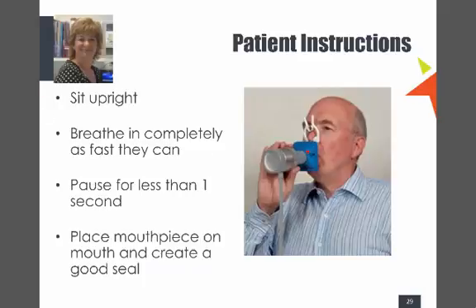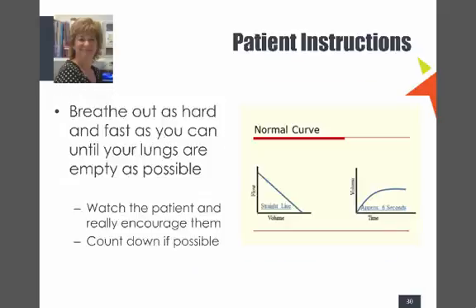The thing that is really vital is the filters. Don't use those cardboard filters that have got nothing in the middle of them, or a minor membrane. Ideally, we really need a proper filter that goes down to, I think it's 0.05 particles, especially in winter. You don't want to be spreading viruses through a spirometer. So again, I'm not going to tell you what to put into your spirometer. They're all different, and you need to go through the instructions of how to actually use it.